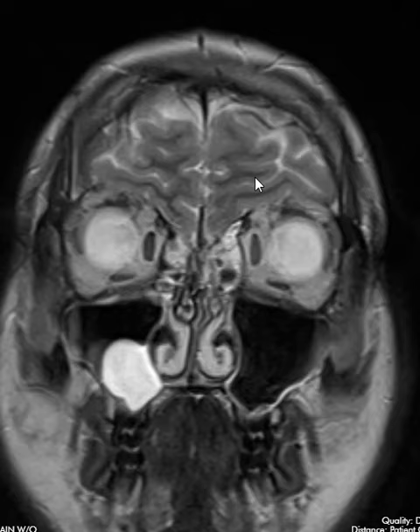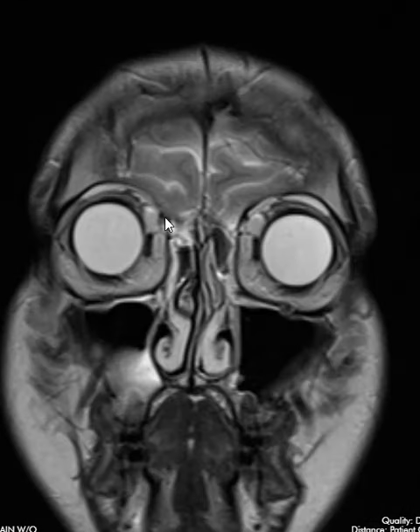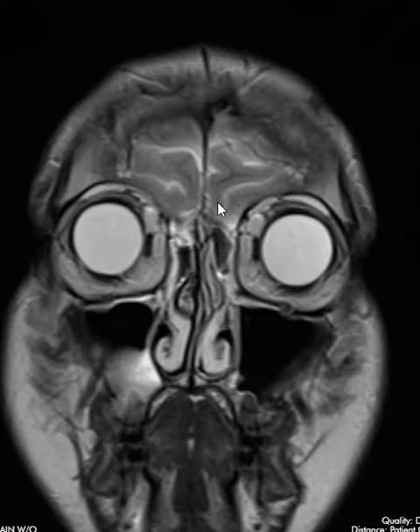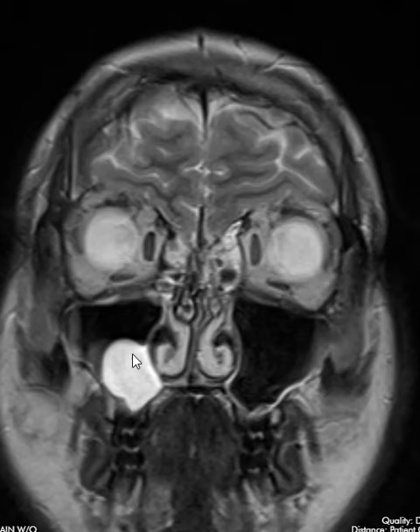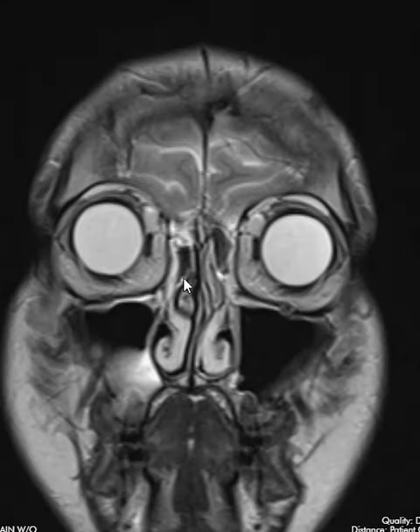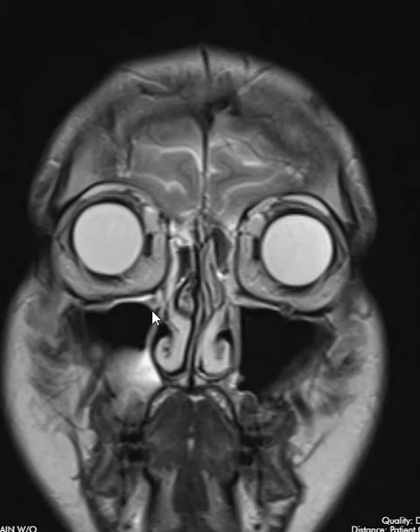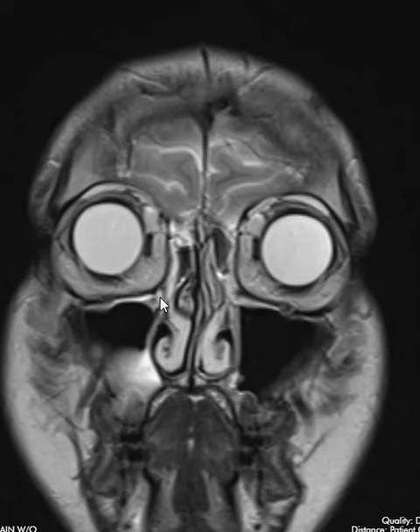I believe these are sinus headaches because the brain looks normal. This is just another view where you can see the right eye and left eye, and the sinus disease from a different angle. This is that left frontal sinus that has the brightness in it. This is that retention cyst in the right maxillary sinus. The sinuses communicate with each other through narrow channels, and there's a channel here that looks like it may be occluded by the mucosal thickening.